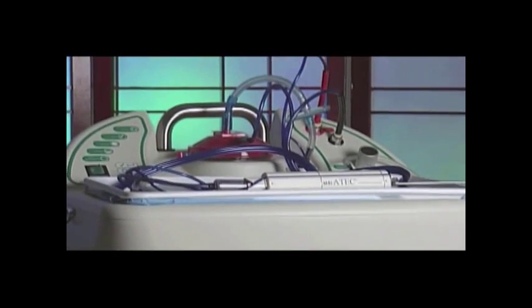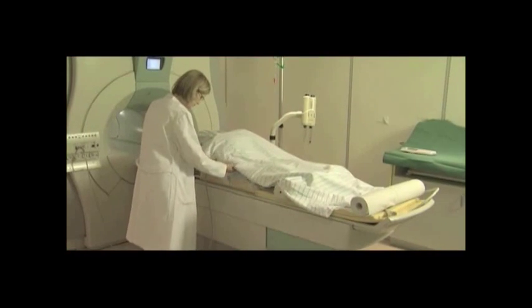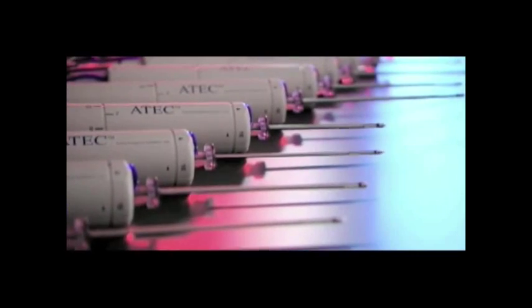Both systems are compatible with most magnets, breast coils, and targeting software. In this video presentation, we will demonstrate the grid method using interventional targeting software. The standard Atec MRI handpiece is used during the procedure.